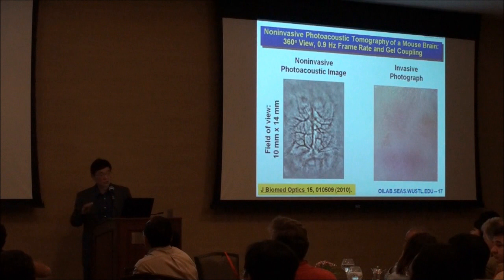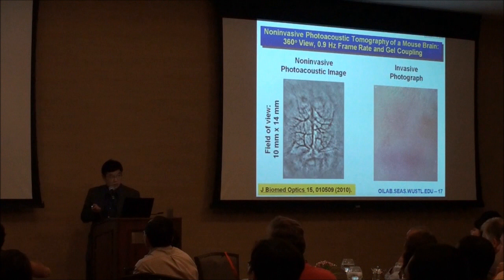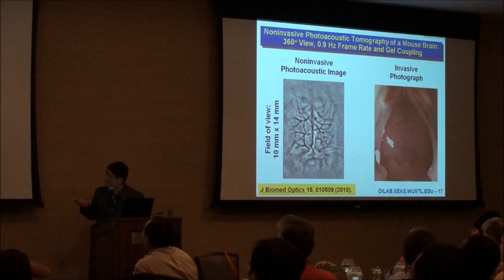And this is when we acquired this photoacoustic image. Afterwards, you can remove the skull, you can see all the vessel structures in the brain cortex, and you see how well our non-invasive image correlates with this invasive photograph.